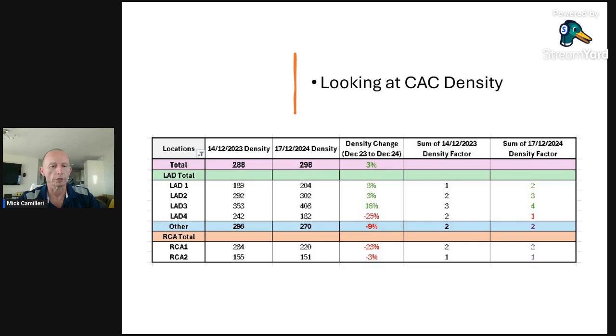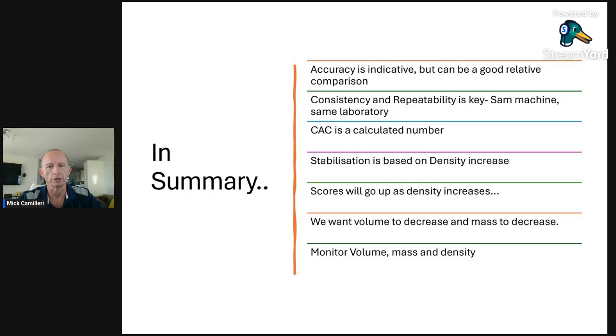These are the density numbers from the last 2 tests. We'll see overall it increased, and on a slice by slice basis, we had some ups, we had some downs and the like. It could be the quality of the image, as I said. We don't normally see density decrease. In my case, I've seen some density increases, which is great, but there's some density decreases. Now, again, is that the quality of the image? Is it the scan? Quite possibly. Will that affect the quality of the score? Possibly, because it is a function of density, but notwithstanding, we're seeing an improvement in all directions there.